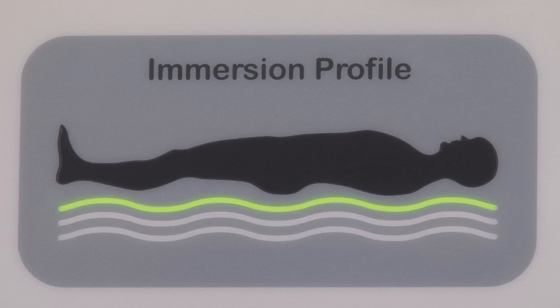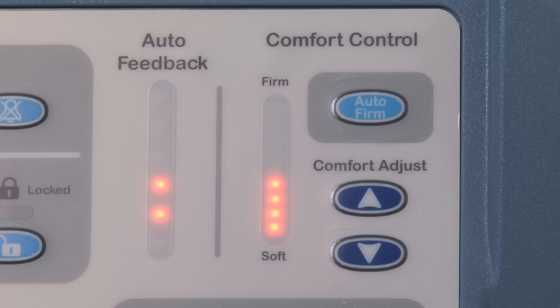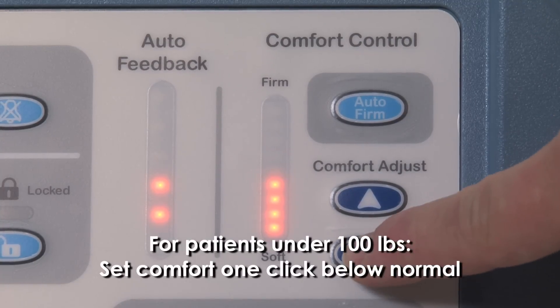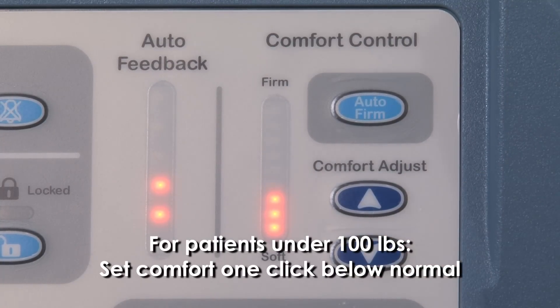Once the immersion profile settles on green, you have the option to manually adjust the comfort settings. The default setting displays four lights. A rule of thumb for patients over 250 pounds is to move one click above normal. Move one click below normal for patients under 100 pounds.